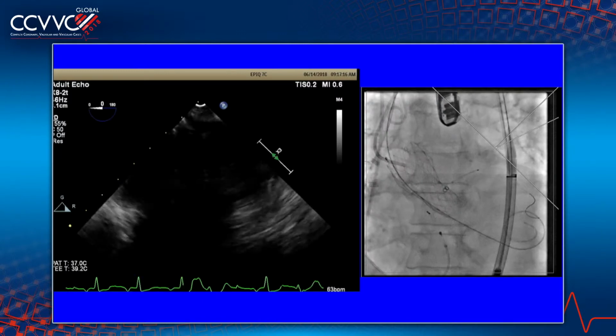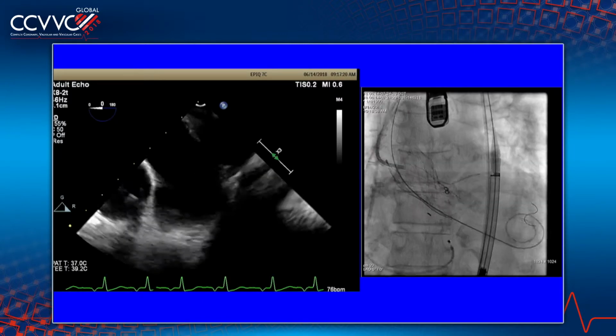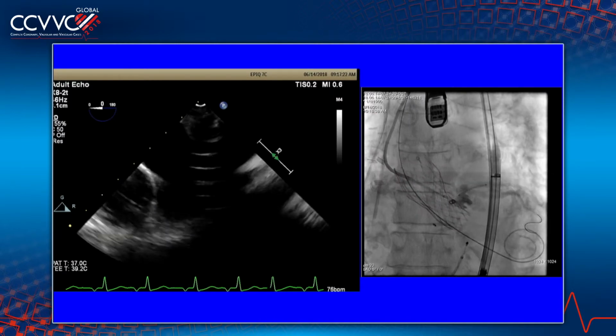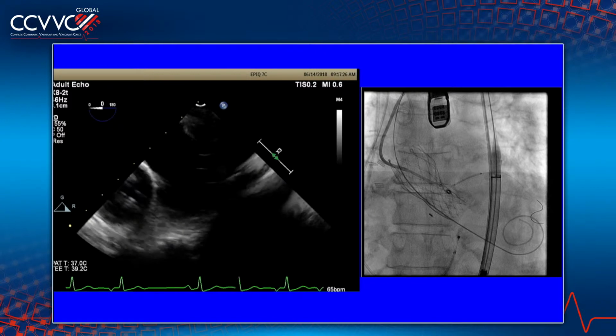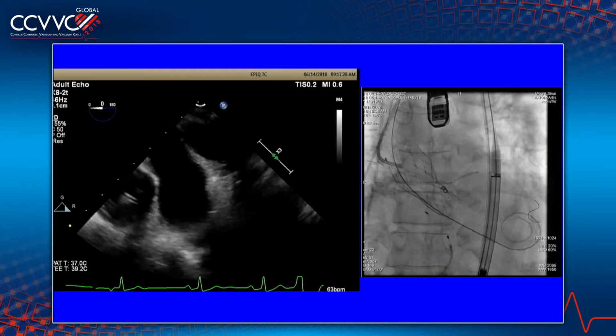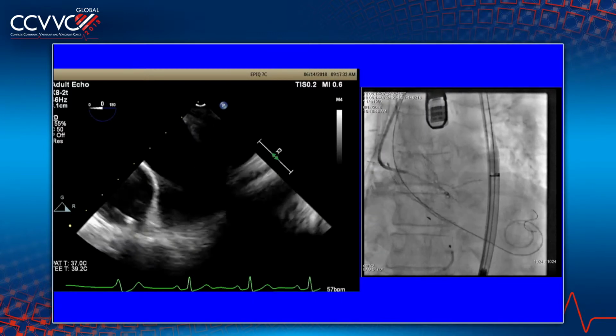Okay, on fluoro, ready? Are you ready for the left main? Okay, yeah, for this. Important to see what that left main looks like. I think left main looks good. Yeah, but just take out everything. What does everyone on the panel think? Do you agree we need to take things out, or wait before we pull stuff out? Let's do a post. Inject. See.